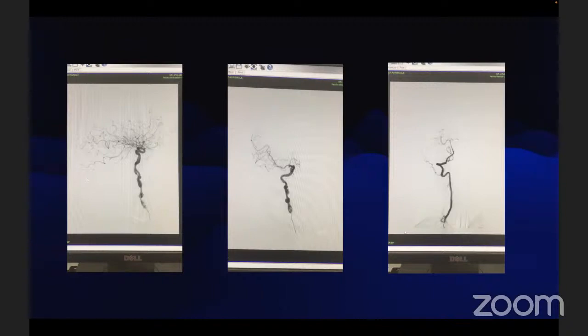And you should not, because there are always chances of dissection in these patients. If there are multiple episodes of embolism or stroke, then only we have to place it. Which diameter should we choose, proximal or distal? You have to go for the major diameter, otherwise it will be a mismatch and the stent is not going to open properly in that part. So the stent is always sized according to the maximum diameter.